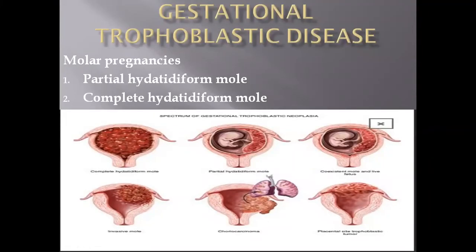Welcome to this video where we will discuss complete hydatidiform mole, making contrast points versus partial hydatidiform mole. In this first picture representing the complete hydatidiform mole, we can see that all the endometrium of the uterus is filled with edematous villi, and there is no normal component of fetal tissue. In complete hydatidiform mole, there is no fetal tissue.